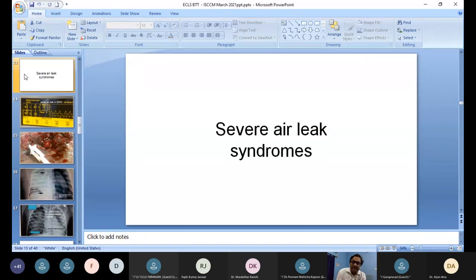to improve veno-venous drainage, and that may improve it. Then you may go on to peripheral VA ECMO. Then you may find you have a North-South syndrome. You have to go into VAV. And you try to avoid as much as possible doing a central VA ECMO in these patients because you want a pristine chest when you're going to do the lung transplant.